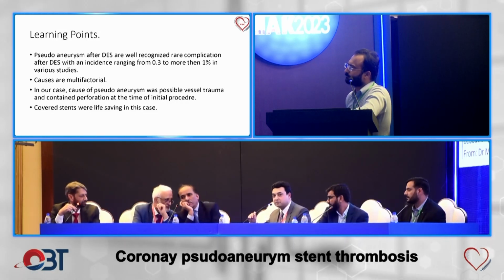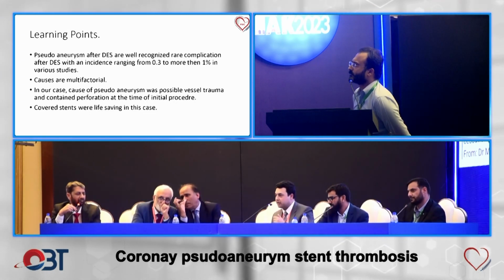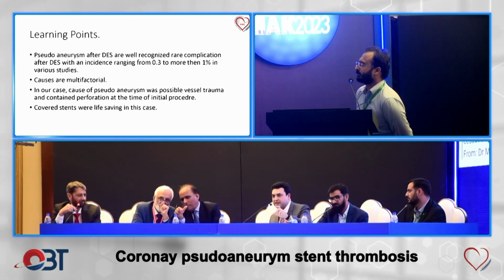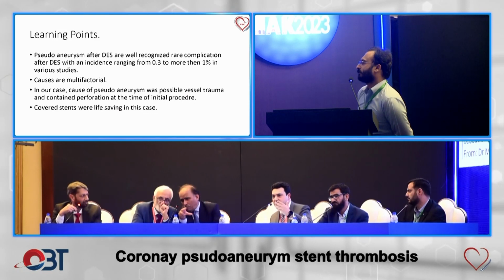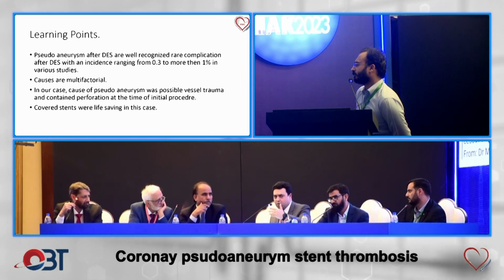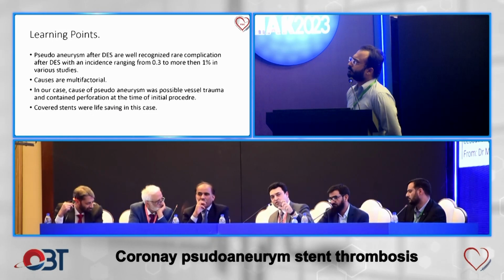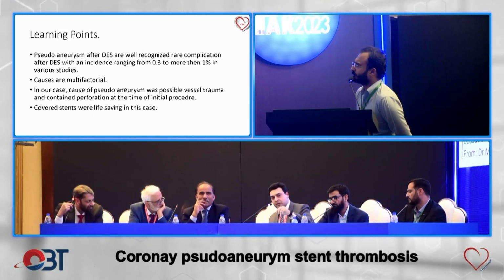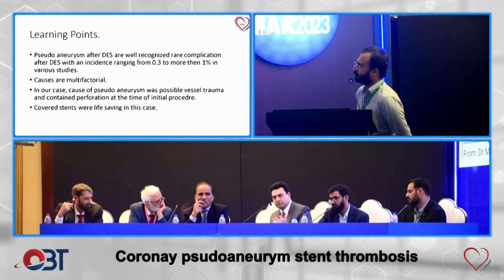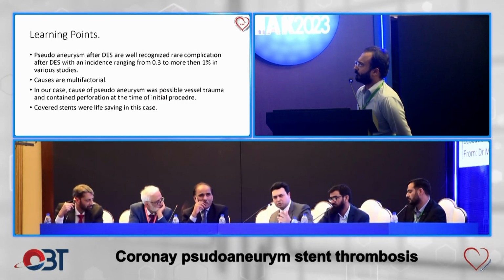So I think it's a wonderful case, to be honest, to start with. But there are a couple of observations. I think we can have a lot of discussion on this case. And the first thing is, I totally agree, there was some haziness post-stenting, and the other thing was maybe there was strut fracture, and there is a complete classification for that. You know, maybe there was a break in the struts, or it could be slight subluxation. I was not sure from that particular view. But the other thing is, maybe initially there was some oozing within the septum, as there was something that opened up, and it was well contained. Maybe there was a fistulous communication afterwards. It's not sure, but it seems to be draining in another chamber, most likely pulmonary artery.